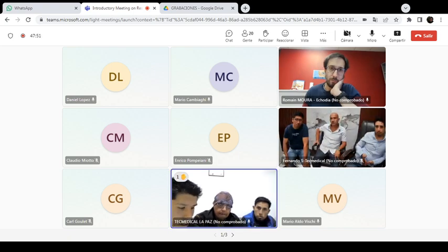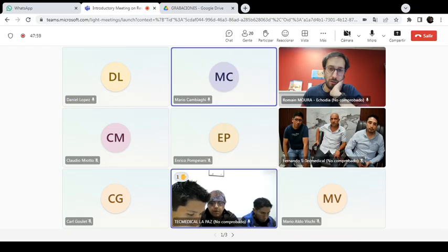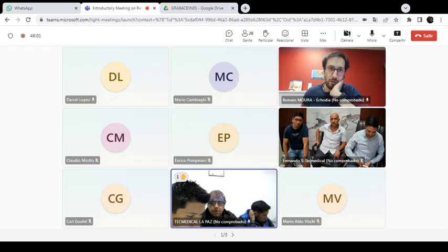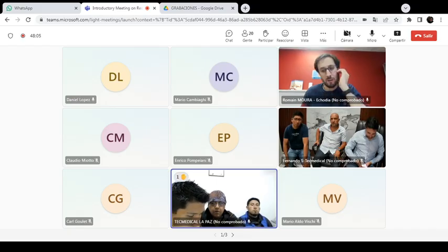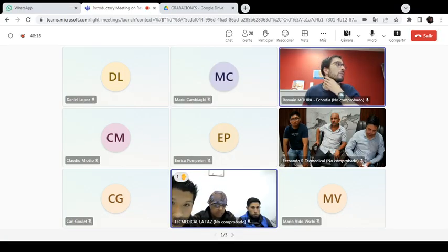Okay, perfect. There is a second question that my colleague has, about the selectable digital linear interference filter by the operator. I don't know how we can show this, if you understand, a selectable digital linear interference filter by the operator. Do you understand? Yeah.